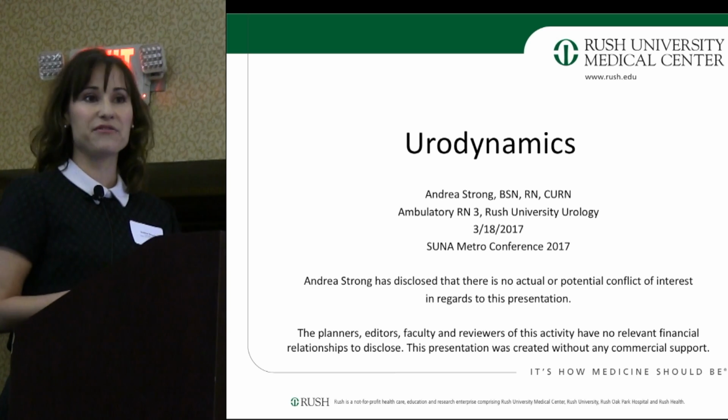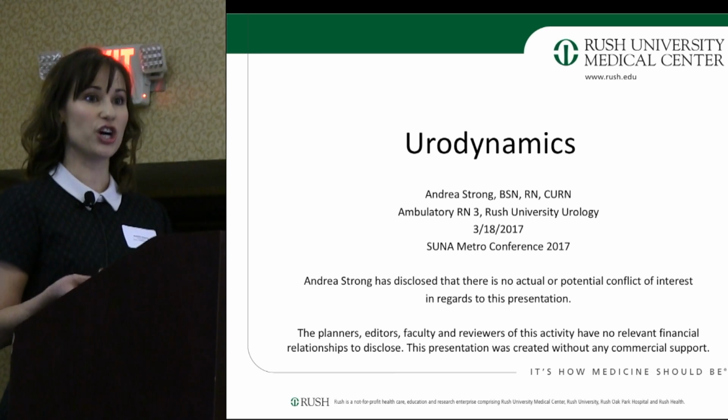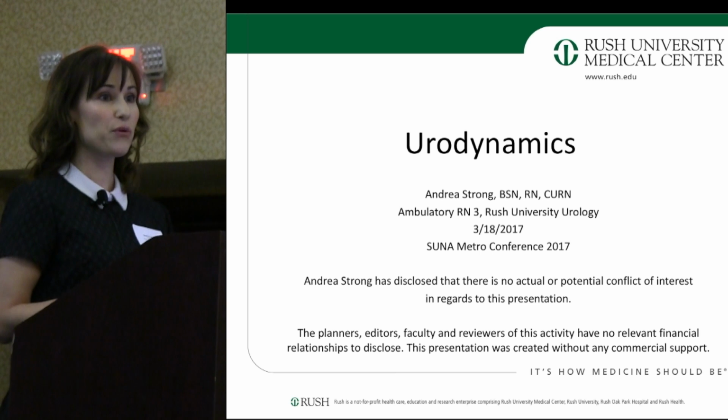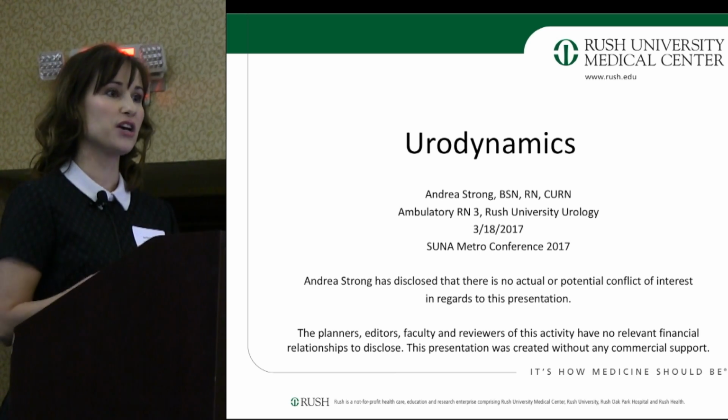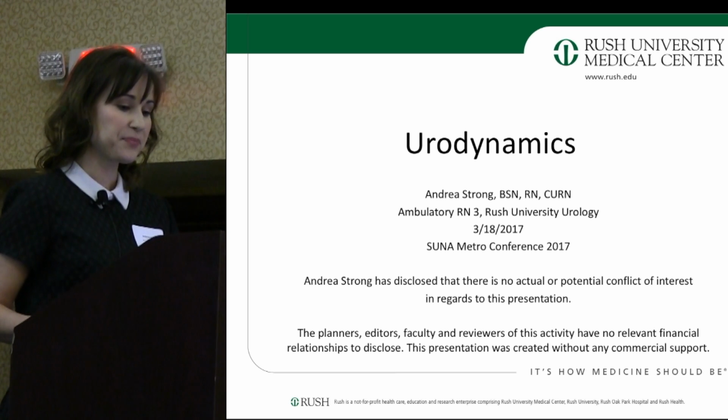I really want to emphasize getting a health history for your patients before starting the urodynamic study. You really need to know what it is that you're looking for in a urodynamic. So I usually talk to the urologist or read the notes. What exactly are you looking for here? So you can seek that during the urodynamic study.